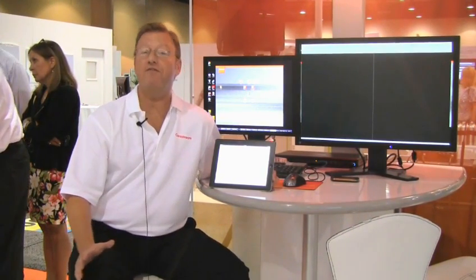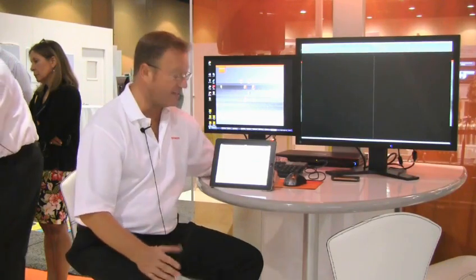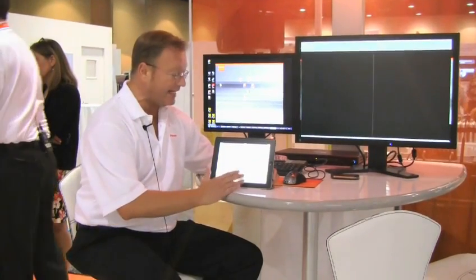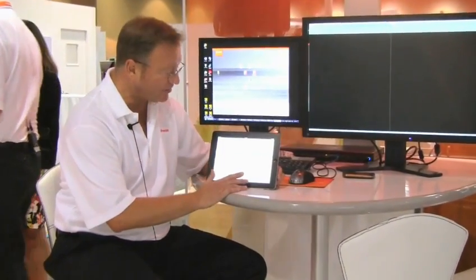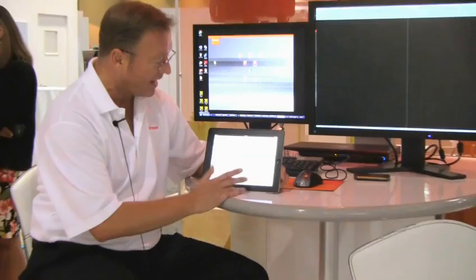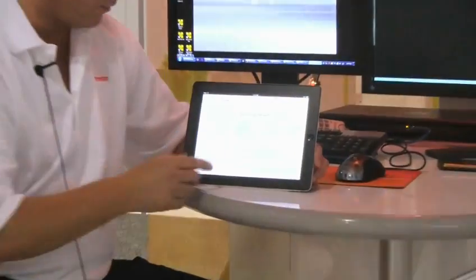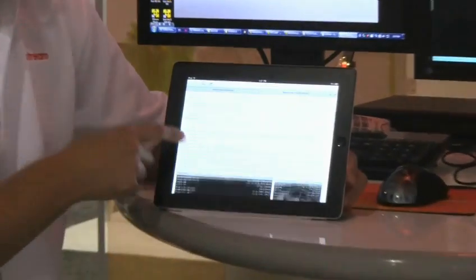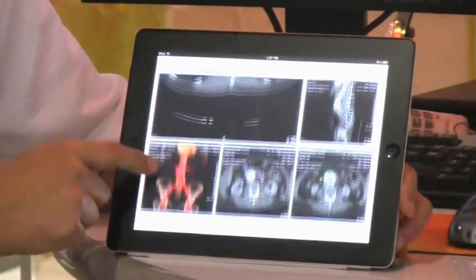The referring physician can use their preferred mobile device to log in and immediately access their basic patient information, including the diagnostic report, which may include key images from the radiologist.